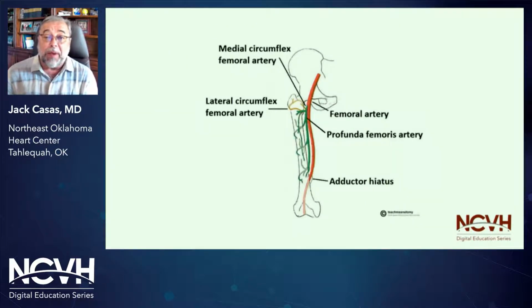A little review of the anatomy. Our sweet spot is to hit the common femoral, but you can see how many vessels there are if you happen to stick too low. And that's usually the biggest problem with an antegrade approach. You have to stick much higher onto the lower abdomen in order to get your needle to go into the common femoral.